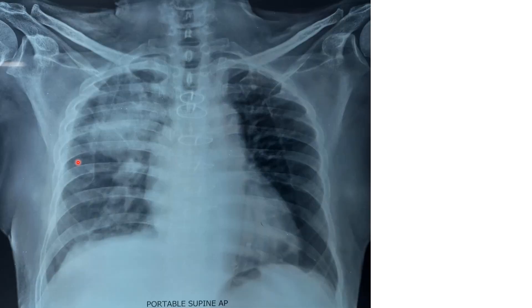Here you have an opacity that is more or less rounded; the margin appears smooth and there is no air bronchogram inside. It appears greater than three centimeters in diameter, making it likely a mass lesion. When you see a lesion like this, it is very difficult to determine whether it is malignant, benign, or a consolidation based on X-ray alone — you always need a CT scan for a better understanding.